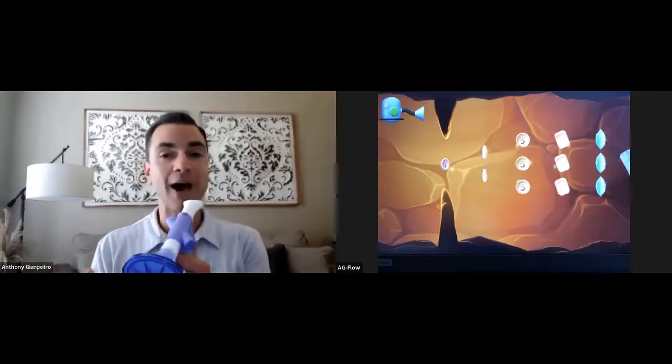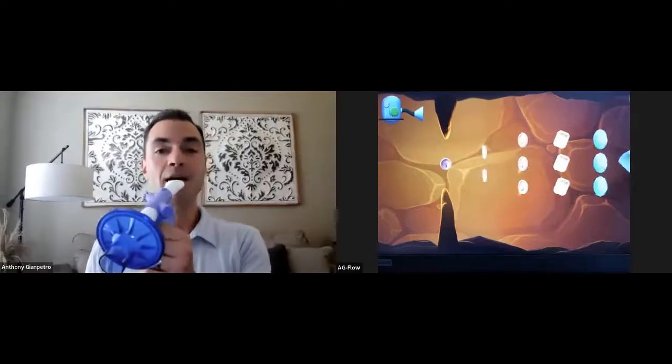Okay. So what I want you guys to think is this is the goal. This is really where you want to get any of your patients that you're doing Diamond Mine with, if possible. Okay. And it's pretty tricky. I don't think I adjusted the volume. So this is still set at level 21, which is a challenge for me, but let's see if I can do this without breaking the rules here. Okay.